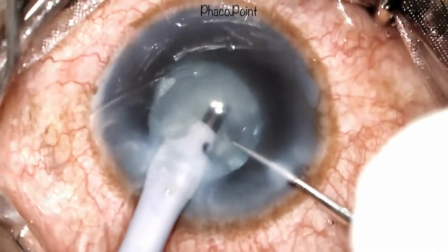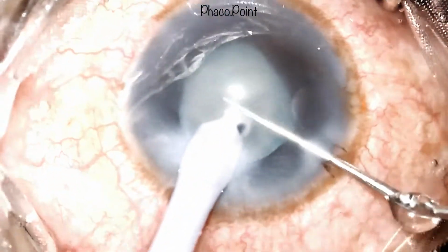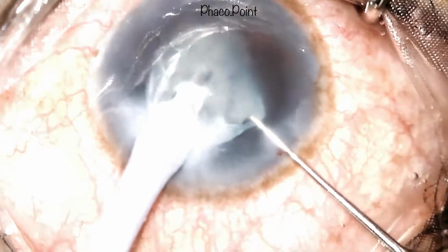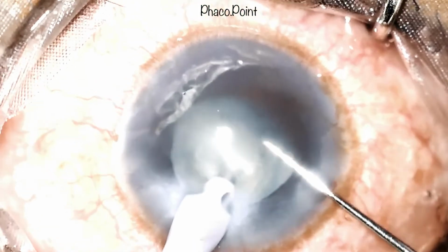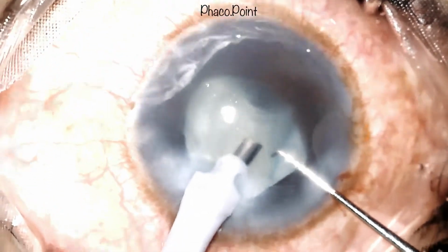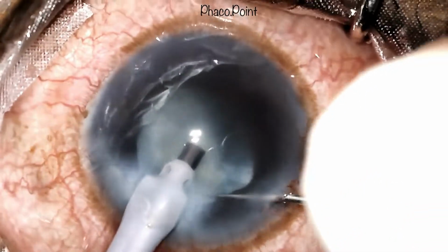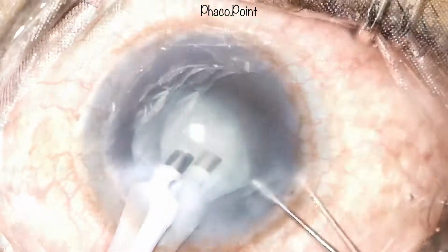It is chopped into two heminuclei, following which each heminucleus is further subdivided into smaller emulsifiable fragments, after which each and every one of these fragments is emulsified. What's different in these cases is the fact that you're working within a very shallow anterior chamber and looking at emulsifying a very large, thick, intumescent nucleus. It's very important to intermittently stop and replenish the viscoelastic into the anterior chamber with a view of protecting the corneal endothelium from significant damage.